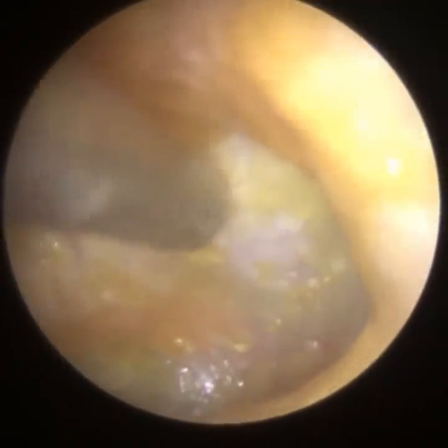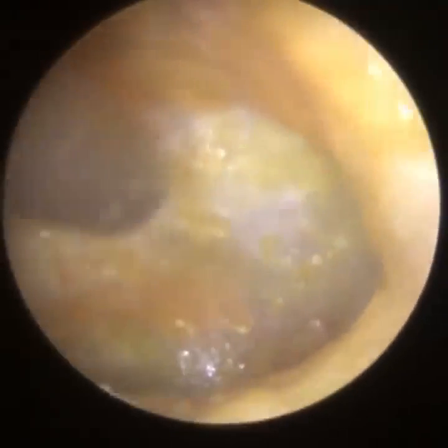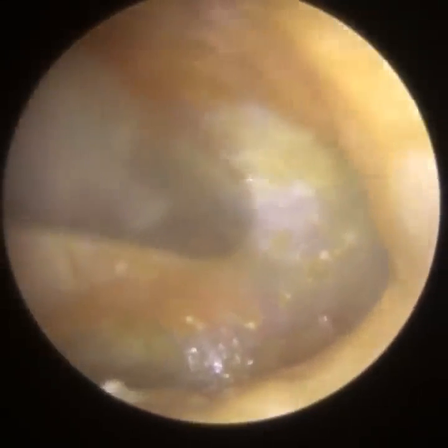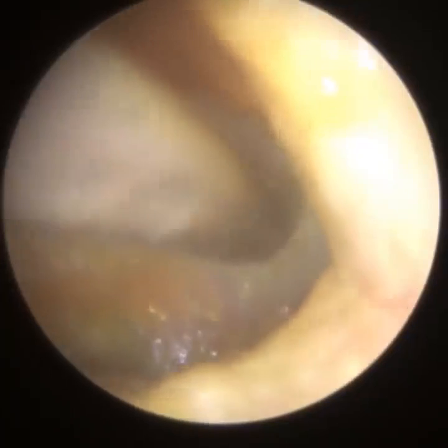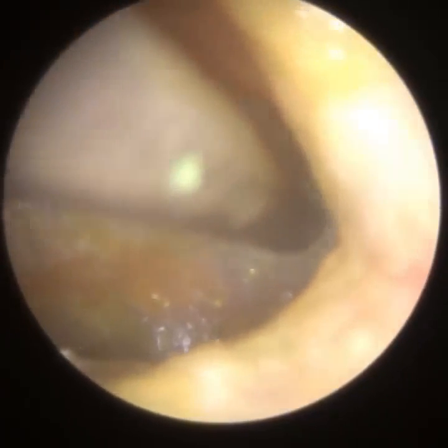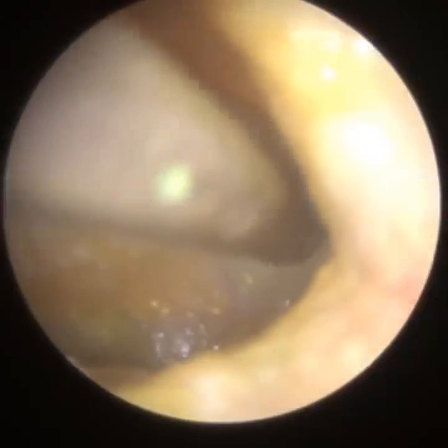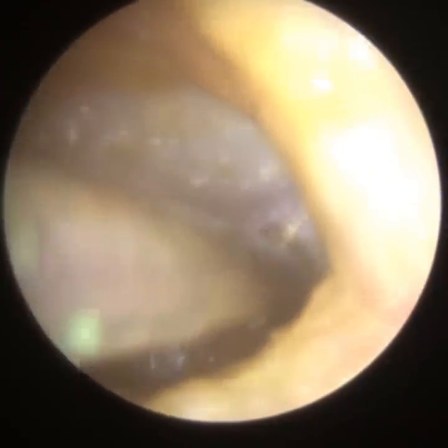Now, sorry I haven't talked much about the procedure because it is almost self-explanatory. All I'm doing is suctioning this debris off the eardrum using a fine-gauge tip. If you stay tuned and watch at the end of the video, I'm going to replay the beginning of the ear so you can see the pre-procedure, and then you'll see the finished result. You can see the difference. And it is a very tedious procedure.